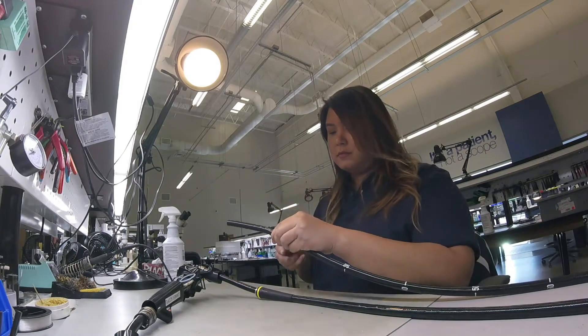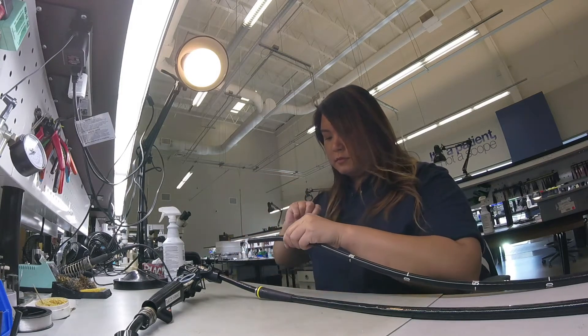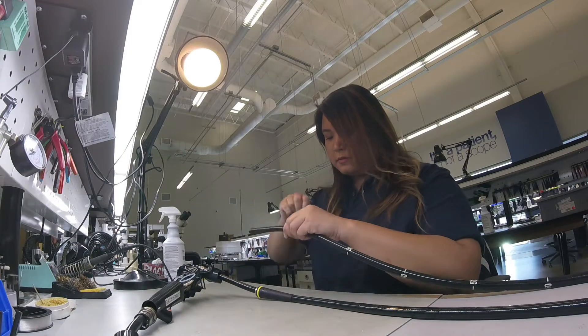On this repair, the technician is wrapping the bending rubber and checking to make sure the angulation is within specification.